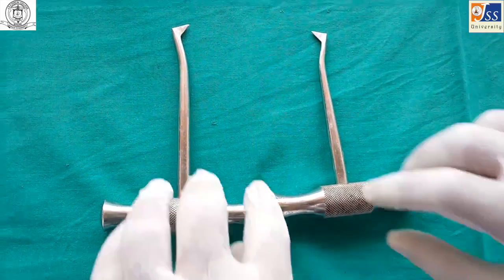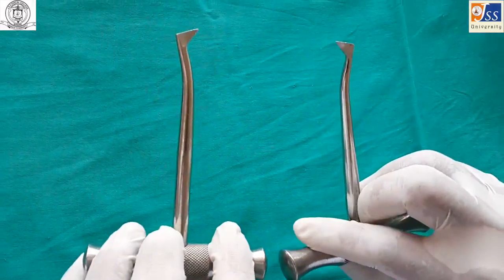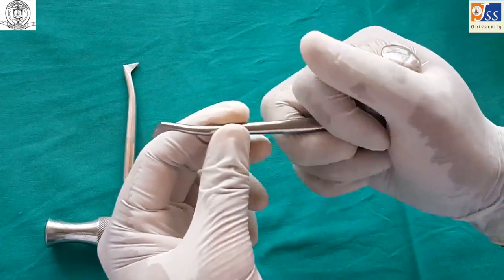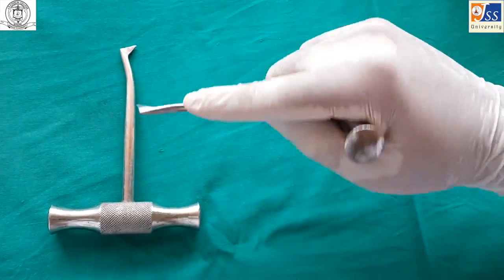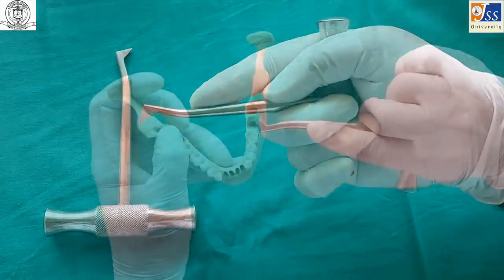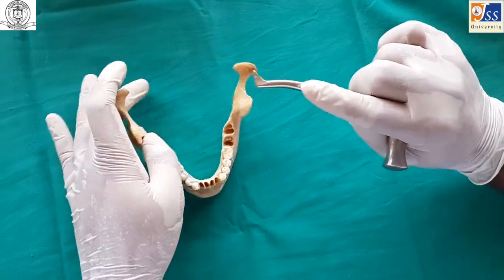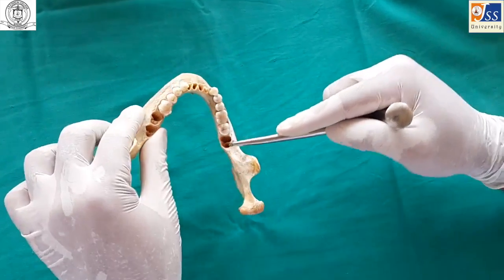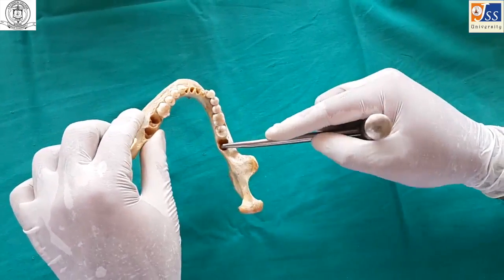The crossbar elevator, also known as Winter's crossbar, is a paired instrument. If one is used as distal on the right side, it can be used as mesial on the left side, and vice versa. It is held in a palm and thumb grasp, primarily used on the wheel and axle principle. It is used for extraction of mandibular teeth, and is useful when one of the roots has been removed — the elevator is used through the socket of that root to remove the other roots.